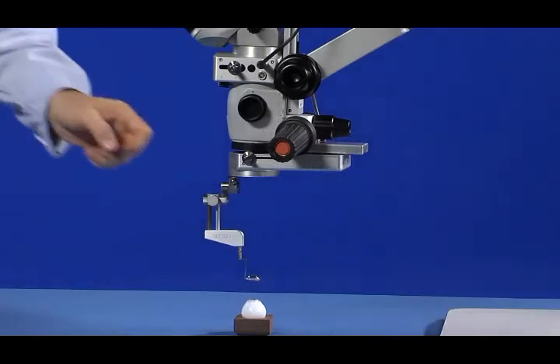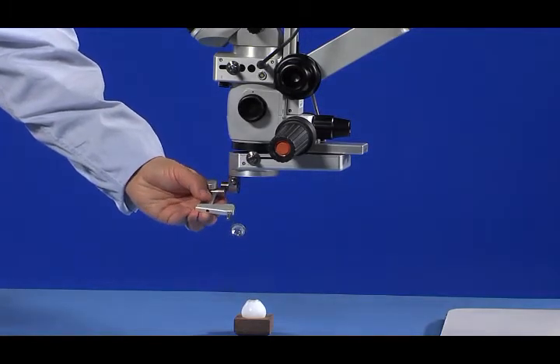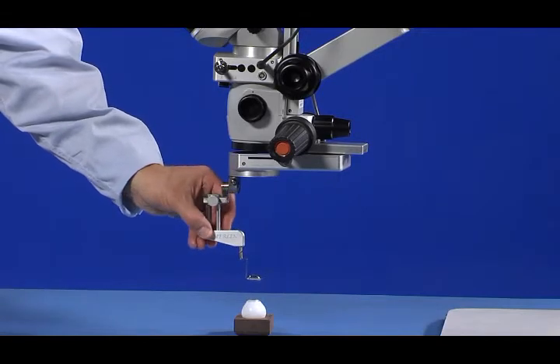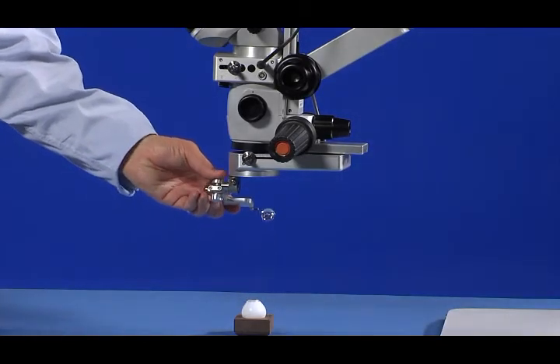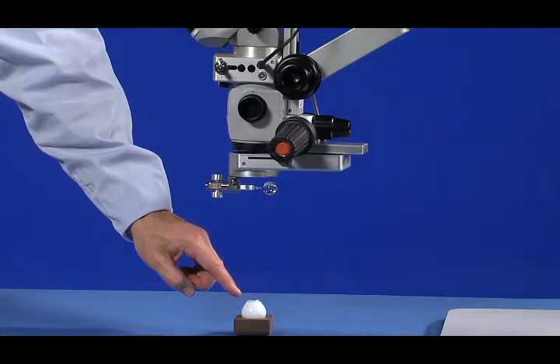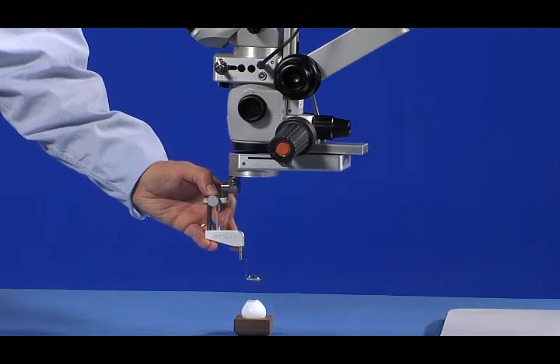During surgery, the LPU is switched between its up and down positions depending on which part of the eye the physician needs to see. The LPU can switch to its up position in either direction. The LPU is in the up position when the physician needs to view the exterior of the eye, typically called the corneal view. The LPU is in the down position when the physician needs to view the retina.